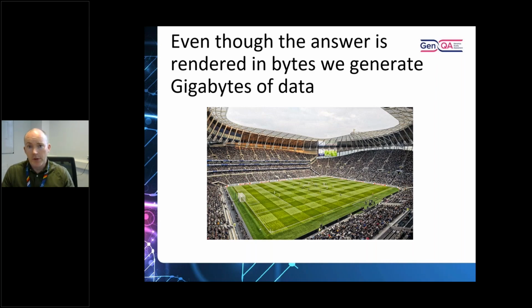So a whole genome sequencing file could be 100 gigabytes. A targeted panel might be a gig. A small targeted panel might be 100 megabytes if you're looking at something really focused. So we're looking at massive jumps as you go into whole genome sequencing or exomes. And all of that data has to be in a format that can be interrogated and interpreted, and you can't give that file back to the clinician, obviously. So you have to get that condensed back down to a reasonable result, and then that has to go into a report, which Jenni will talk about, reporting formats, after this.